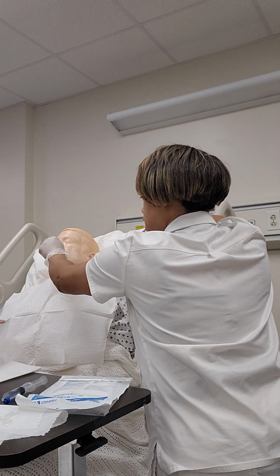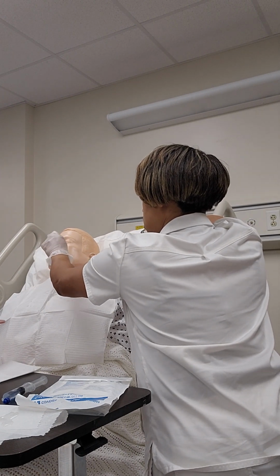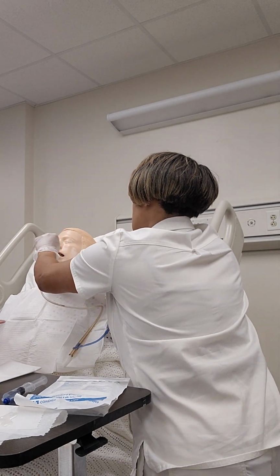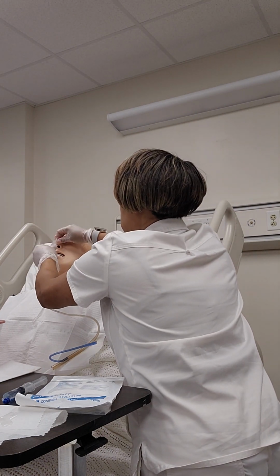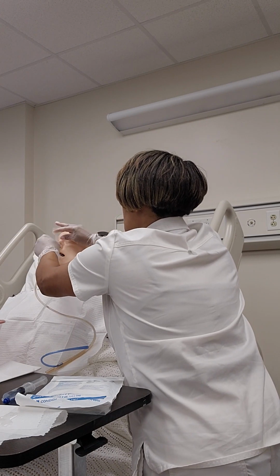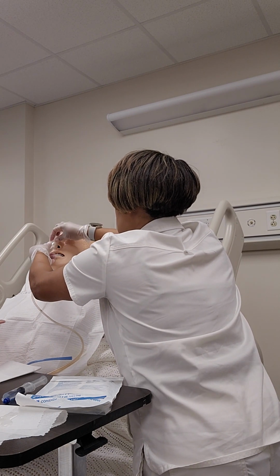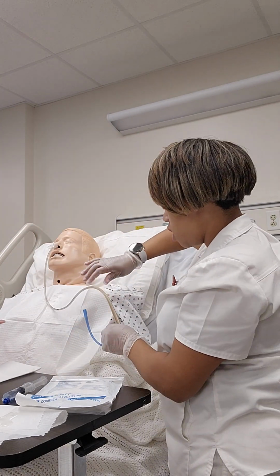So once I get it in there, I'm going to mark this spot on the patient's nose.